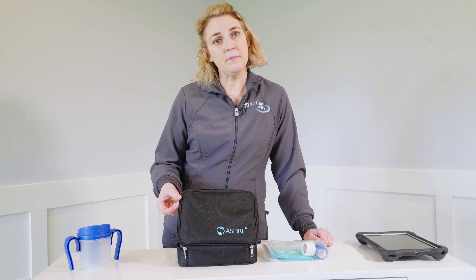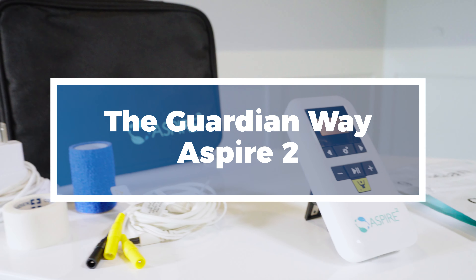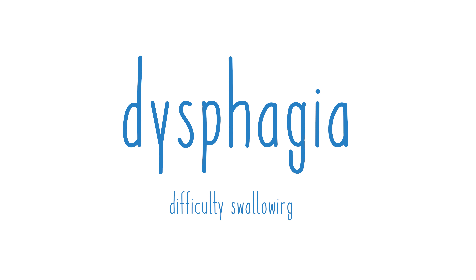Today we're going to be taking a look at the Guardian Aspire 2 Swallow Stim. This device can be used both for assessment and treatment for patients with dysphagia. So let's take a look.